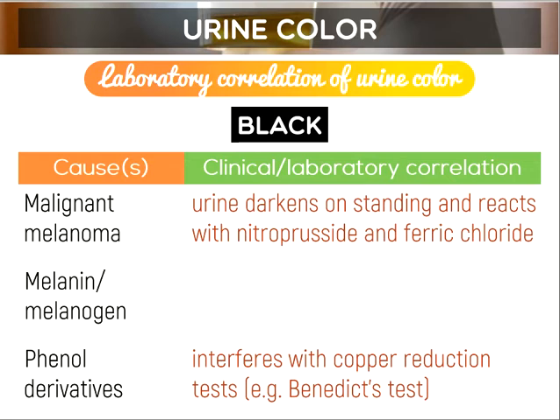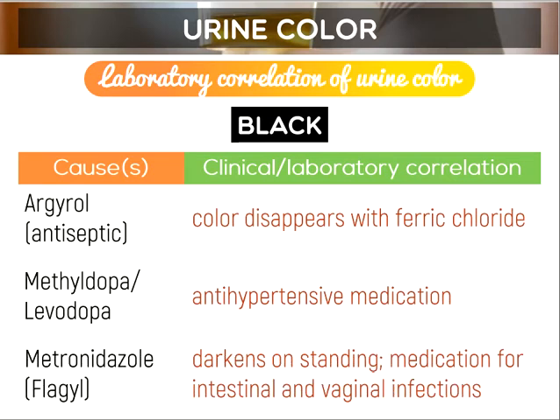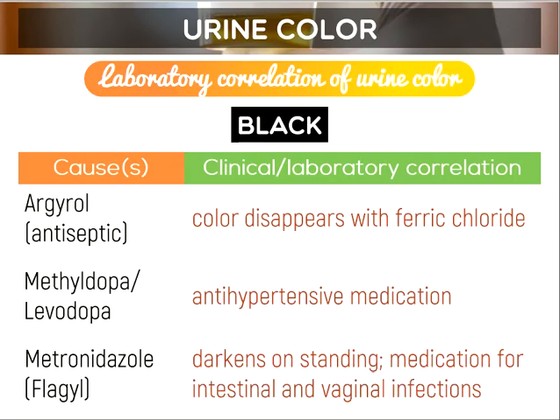And then, we also have your phenol derivatives. It can also be argyrol, methyldopa or levodopa. Are you familiar with this from your pharma class? Metronidazole is also a medication. So, that ends the laboratory correlation of urine color.